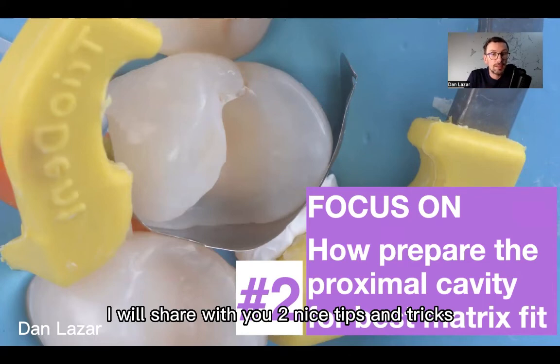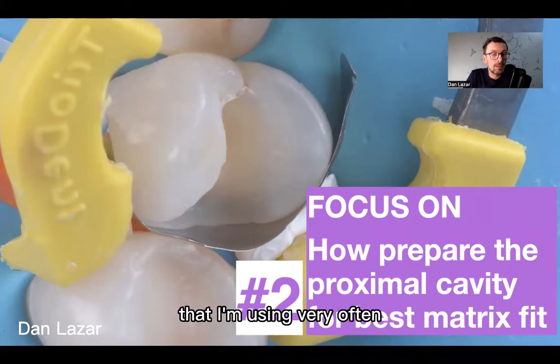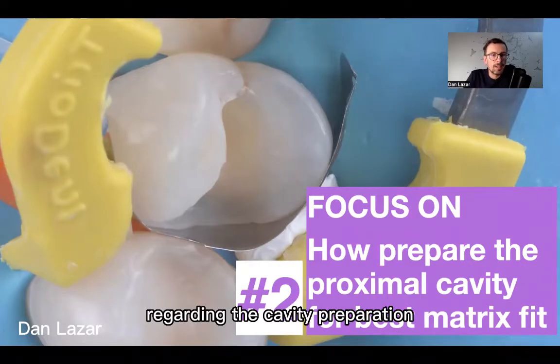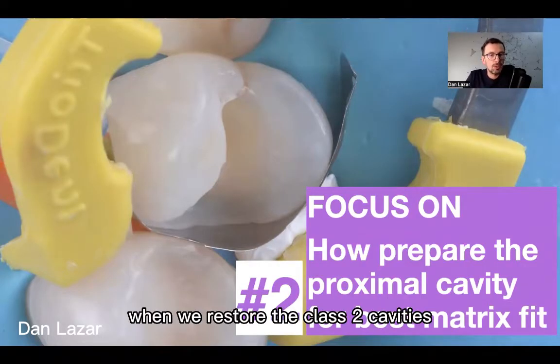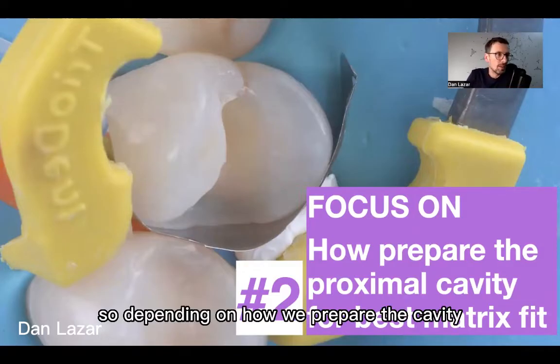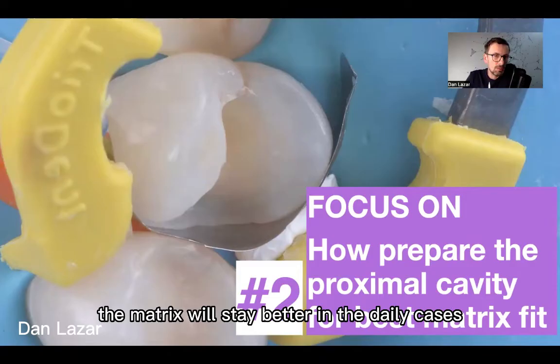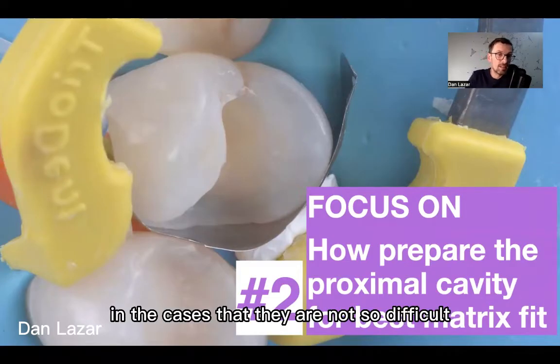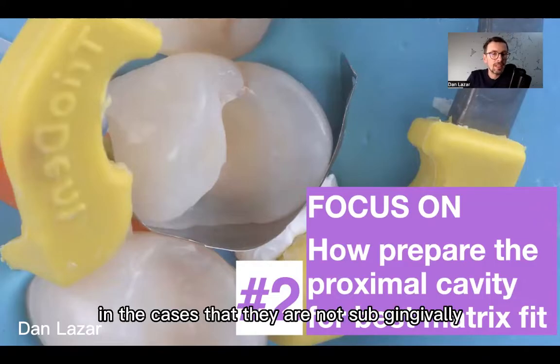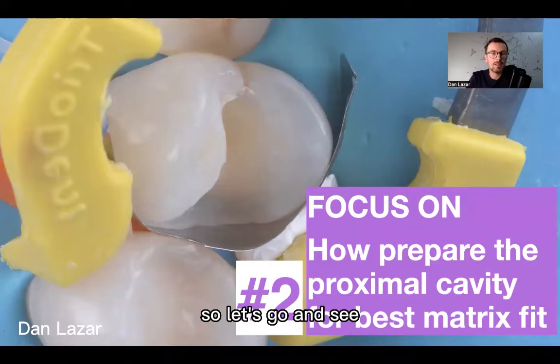I will share with you two nice tips and tricks that I'm using very often, and I found it is very predictable regarding the cavity preparation when we restore the class two cavities. Depending on how we prepare the cavity, the matrix will stay better in the daily cases — in the cases that are not so difficult. These tips work mostly in cases that are not subgingival or deep cavities.